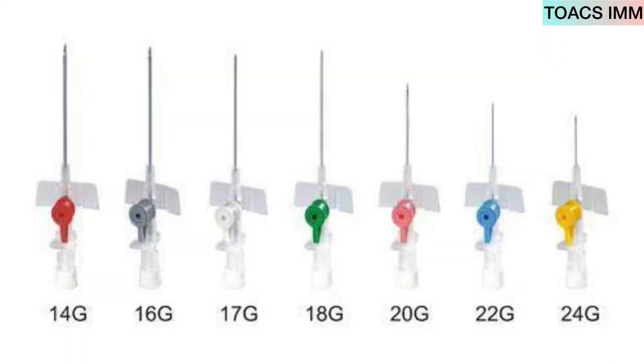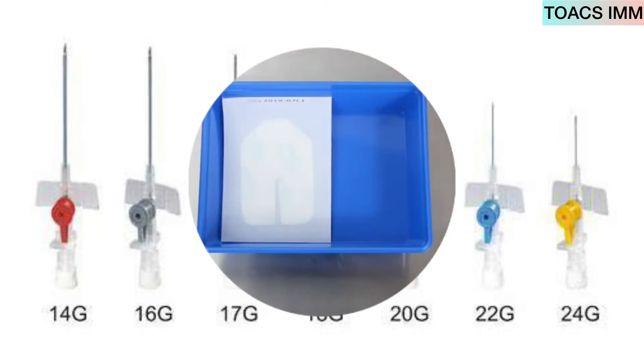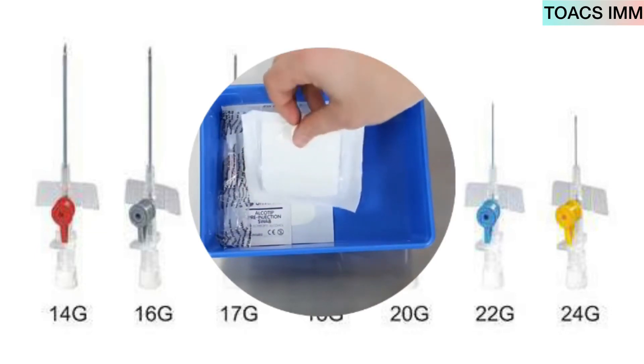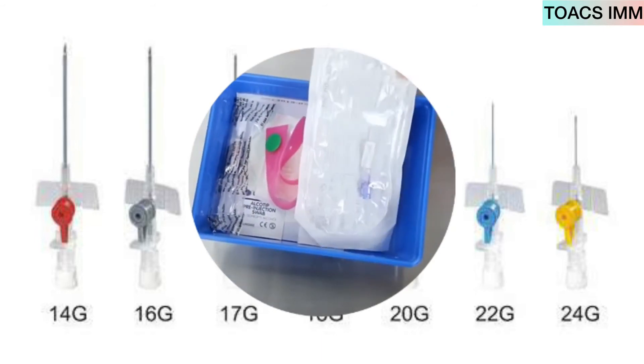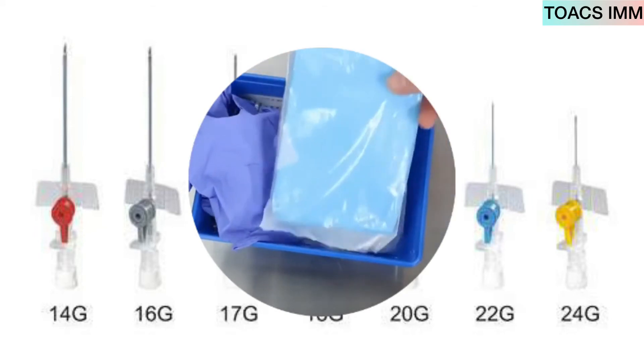First of all, we clean the tray, then clean the equipment, and place the equipment in the tray. The items are: cannula dressing, alcohol swab, pre-filled saline, gauze, tourniquet, cannula, extension set, and gloves.